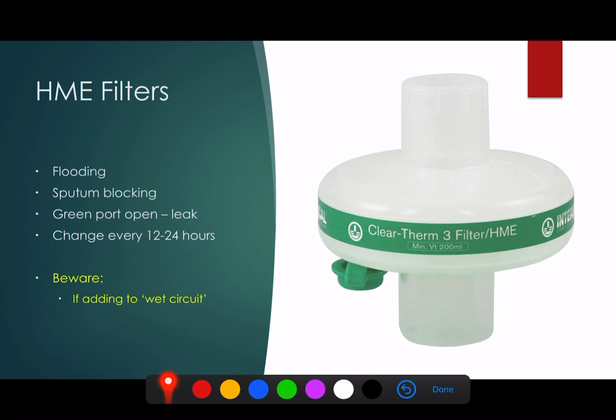Now, in intensive care, we often use wet circuits. So this is wet humidification and warming of the gases that go into the patient. If you are using a wet circuit, and most patients with viral pneumonia such as COVID, we're going to also be using a filter to prevent viral particles from coming out into the environment. Be very careful, because that wet circuit is going to be increased humidity coming in, and that increased humidity is going to cause flooding of this, and again the same problem of increased pressures and an inability to efficiently ventilate the patient.